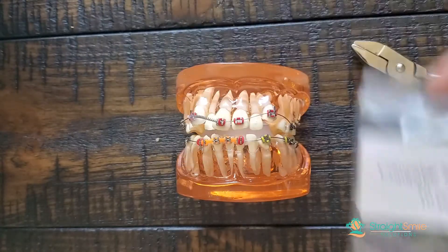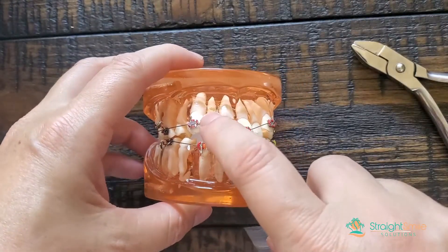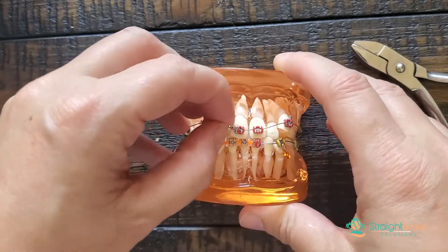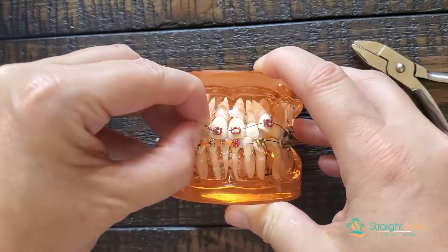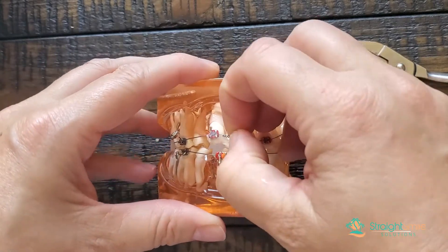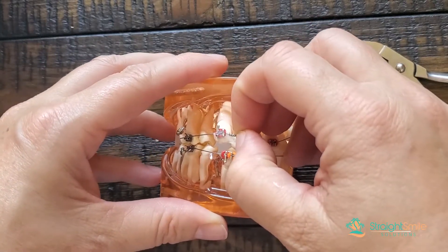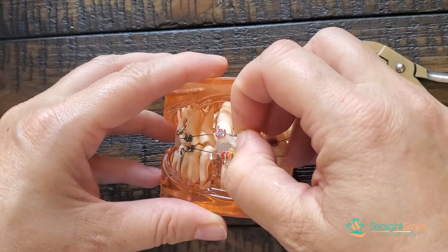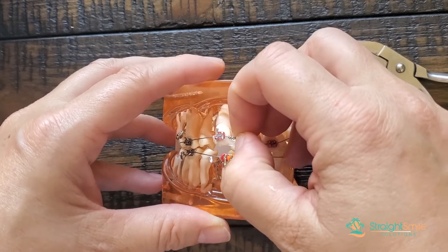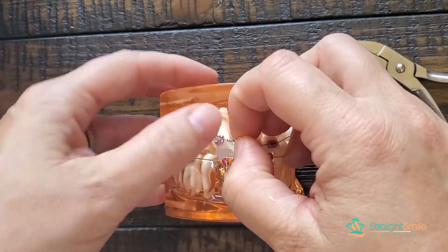You can see there's an open coil spring right here. Let's say I wanted to reactivate it. By the way, this tie on number eight should most likely go over the whole bracket — forgive me — but you are going to reactivate it in a place, say right here. You can see where I just slid this over. This is where you're going to put your crimpable stop right there.